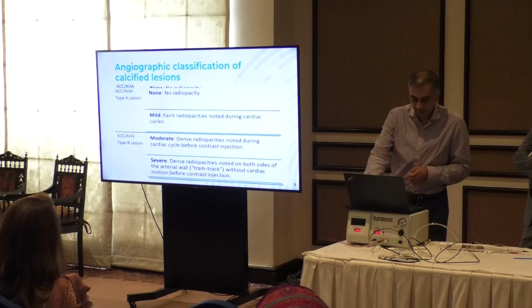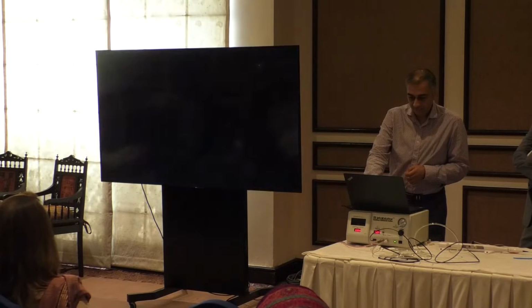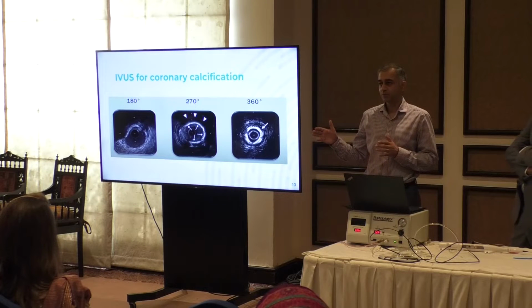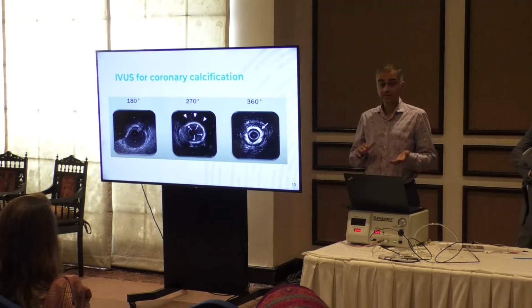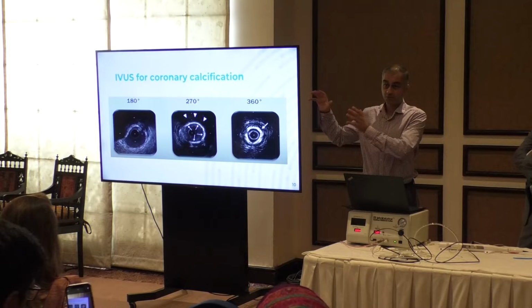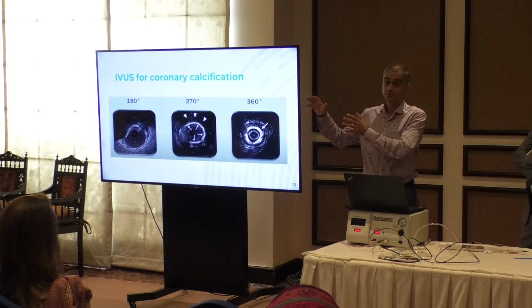That's just the classification of calcified lesions, the ACC-AHA classification. But often when we are doing rotablation, you will hear operators talking about intravascular ultrasound. These are complementary technologies, because the IVUS will help you determine what sort of calcium modification tool you want to use.